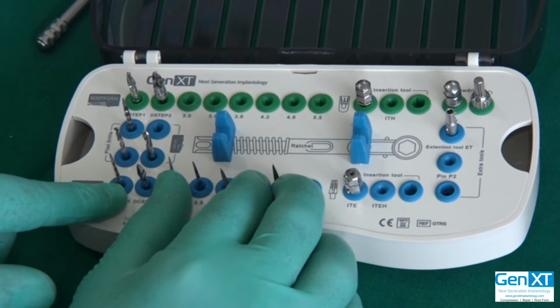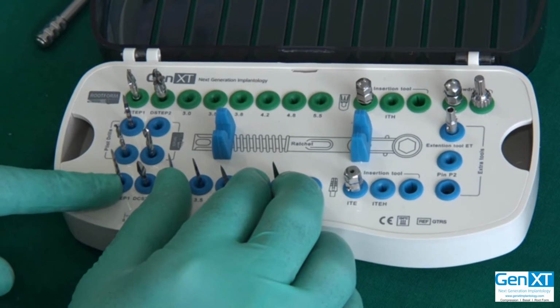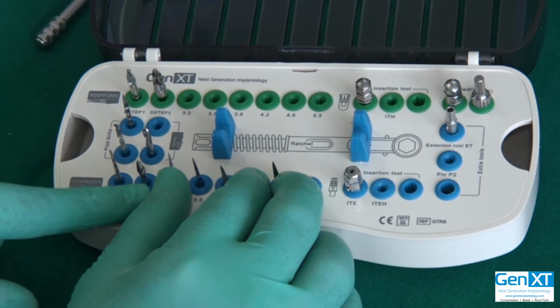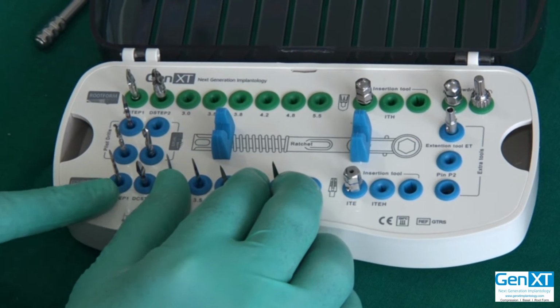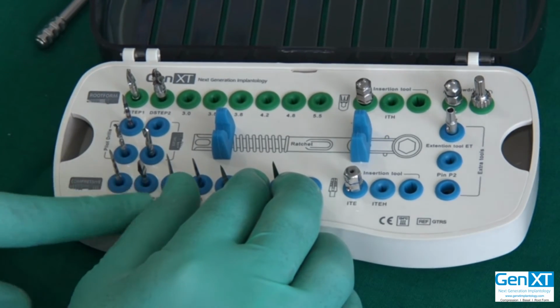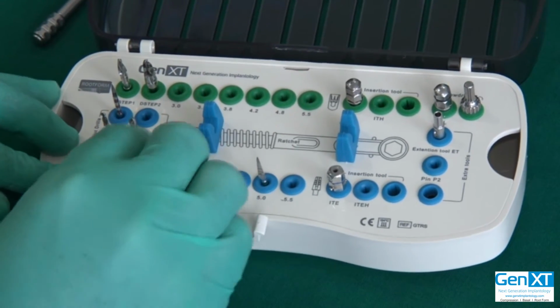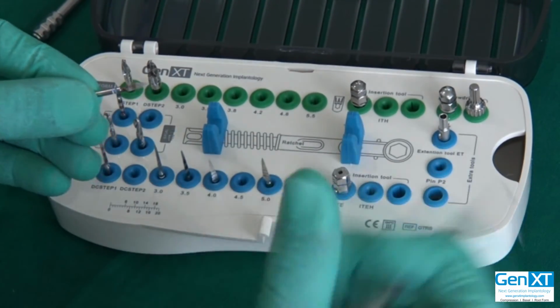As I said to you, in most cases we are finding that just using the precision drill and 1 drill we are able to place most implants. And sometimes you only use a crestal drill to widen the crest. So at some point maybe you may receive a message or an email saying these drills are available. If it interests you, basically we have a crestal drill for the compression also.